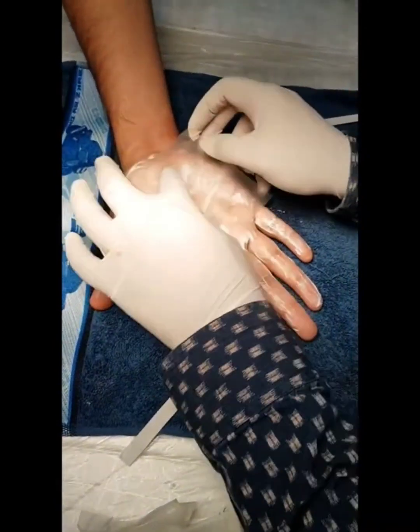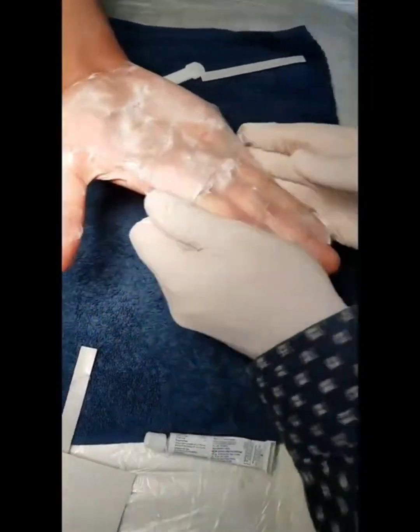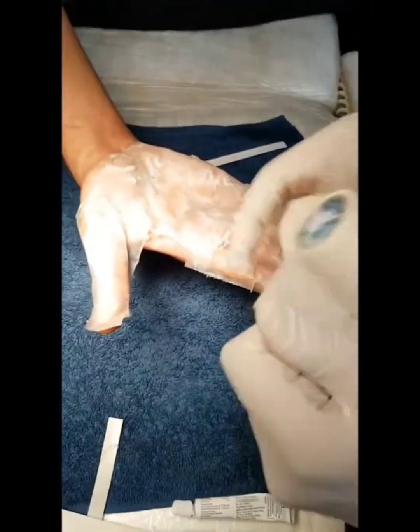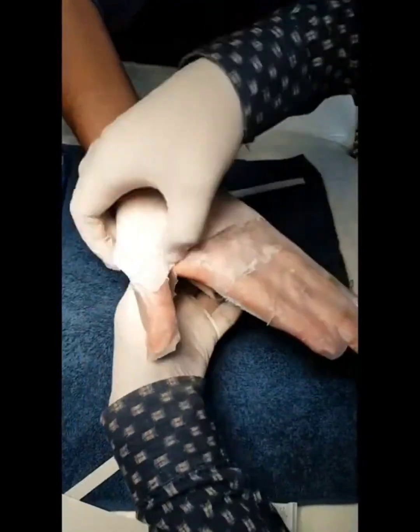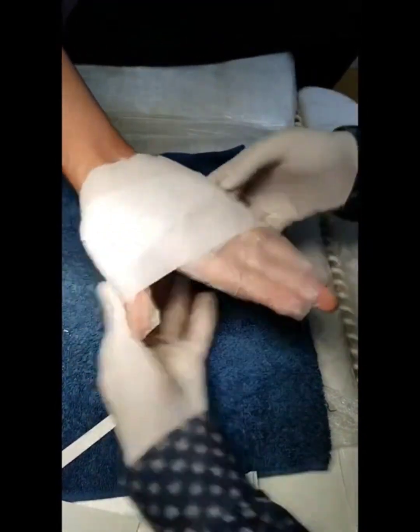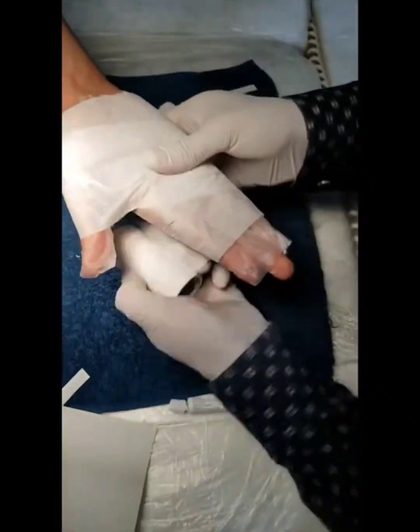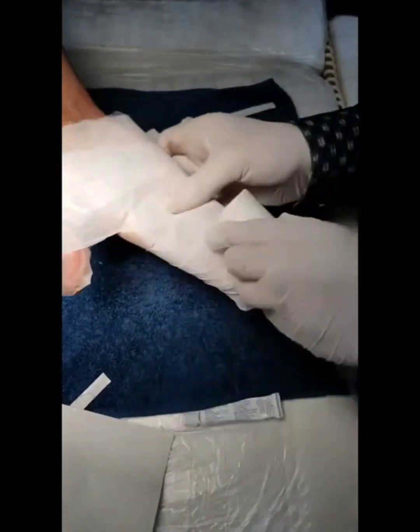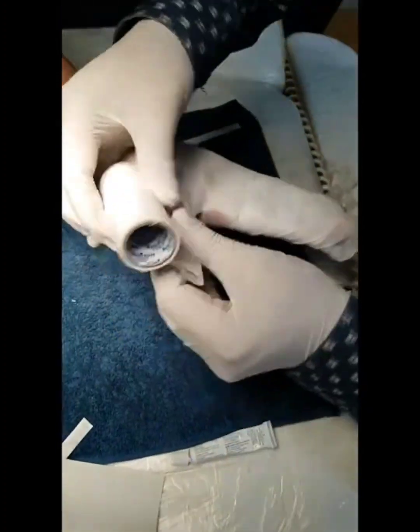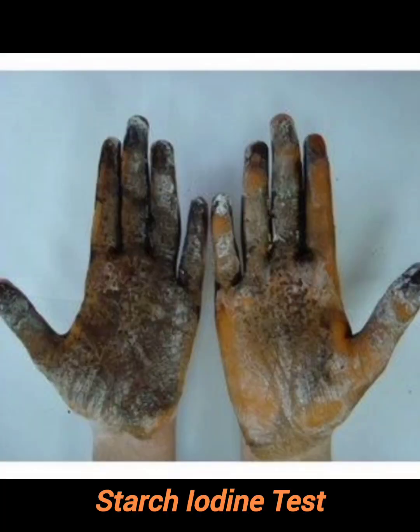The occlusive tape that comes along with the anesthetic cream is applied over the palms and fingers. A micropore paper tape is then applied all around the palms and fingers to give a thick occlusion. It is tightly wrapped around all the fingers.